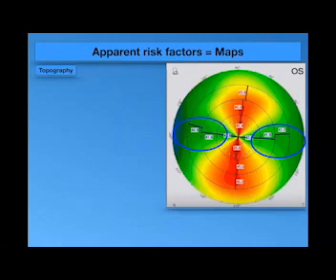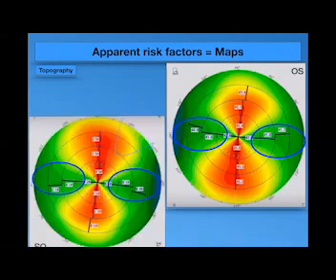We missed it. The corneal skewing is a very important sign to consider or to suspect keratoconus, abnormal topography. The skewing in this topography, which is shown in the slide, is a perfect typical one. The vertical one is steep, the horizontal one is flat, and the angle between the vertical and the horizontal is 90 degrees, a perpendicular angle. It is the normal astigmatism with the rule.